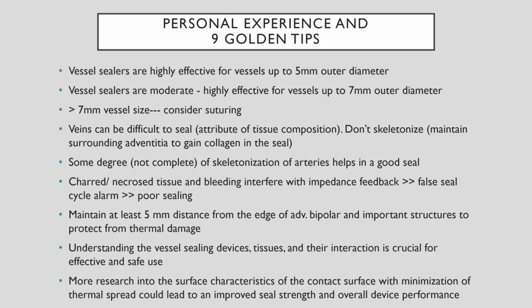Maintain at least 5 to 6 millimeter distance from the edge of advanced bipolar and any important structures, because most of the companies claim that their lateral spread is either less than 1 millimeter or 1 to 2 millimeter. So it is fairly safe to say that if you keep 5 millimeter distance minimum, at least, from all the important structures between the edge of the bipolar and the important structure, you would be riding in the safe zone.